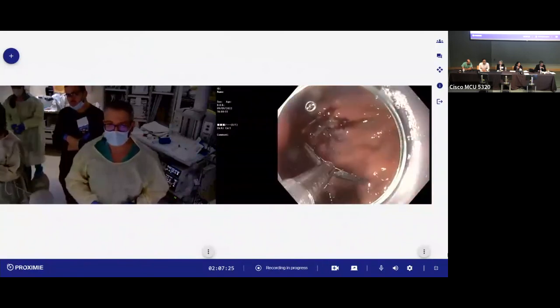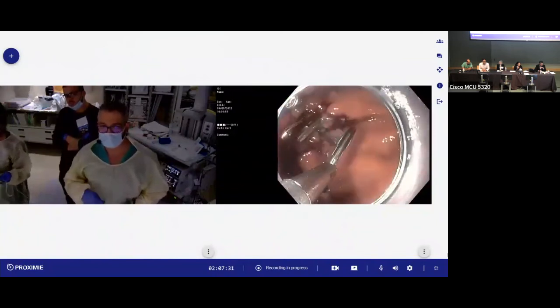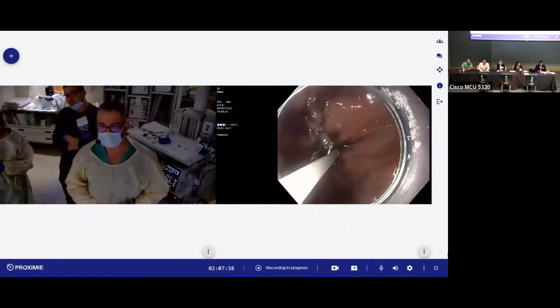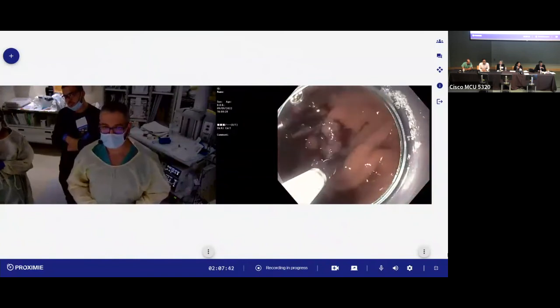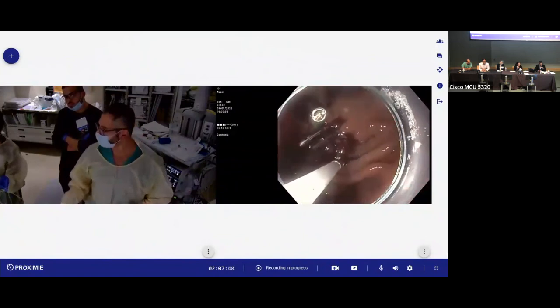1 to 7. So it's very important to be perpendicular on the line of closure. So that's why I'm choosing 1 to 7 here. Close. Close more. All right. I think that's good here. But I feel like once I put this, I might need another one. But let's deploy it.